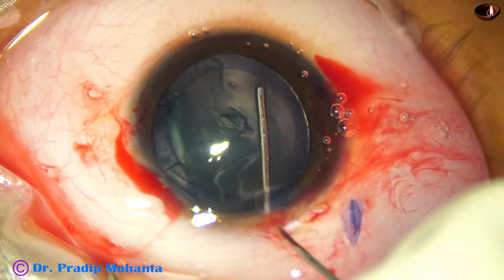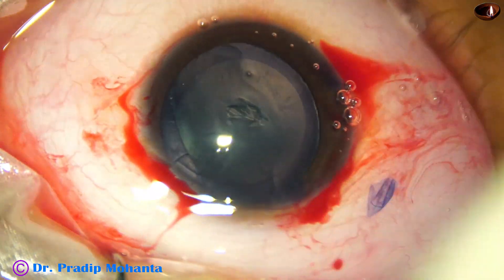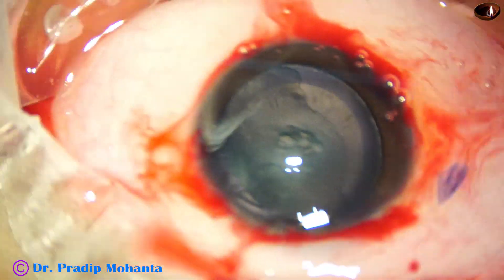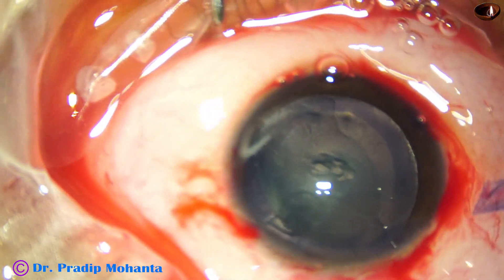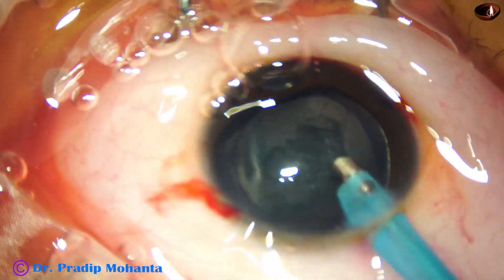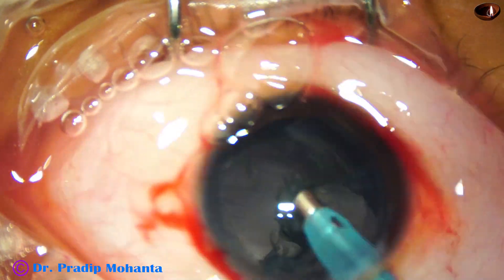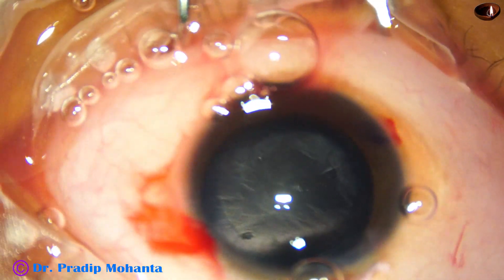A beat of hydrodissection is done. We don't need any ultrasonic energy in this case — just have to aspirate this lens matter. The phaco needle goes in with its bevel down. The lens matter is aspirated. It takes only a few seconds to do the aspiration.